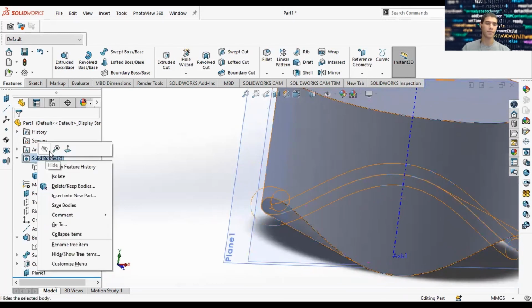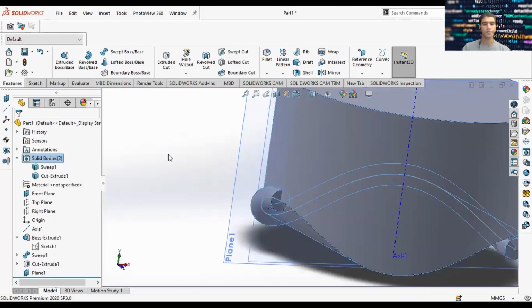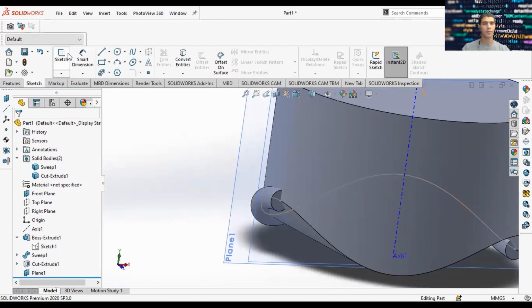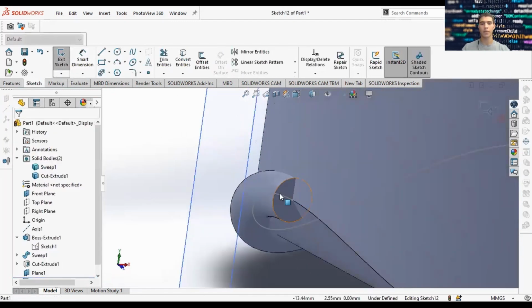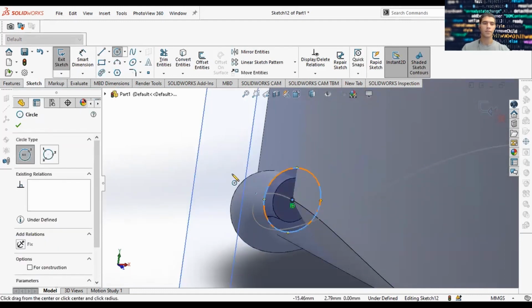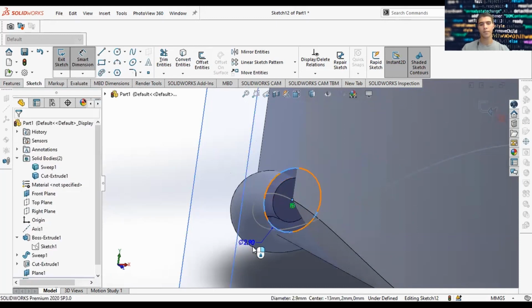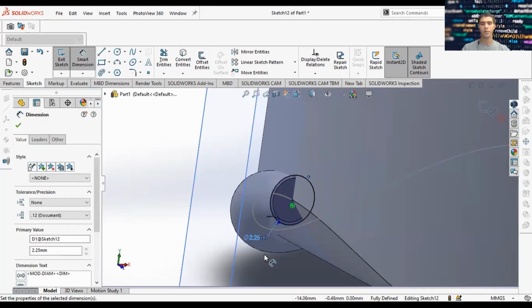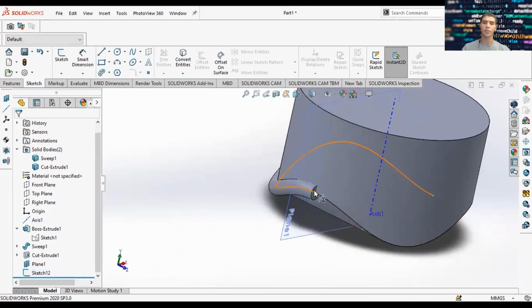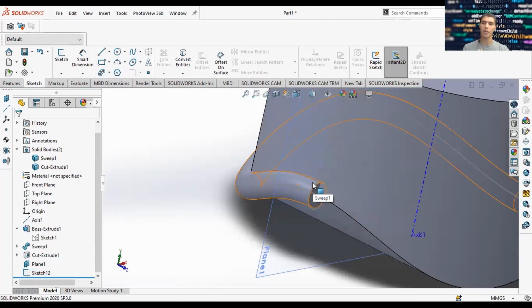We bring back our body. There's our solid body, and there's our sweep. So now we're going to sketch onto the sweep. Click sketch, and we're going to choose a face. We're going to use this face that we used for the sweep to sketch on. We had our front plane, and now we have our plane 1, which is a plane that we made at an angle to the front plane. We're going to sketch on that one too.